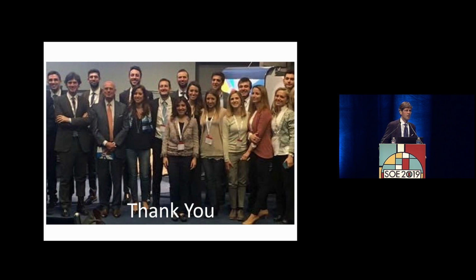What I can only propose and suggest is to always use the same machine when we try to follow the patient, at least. But also in this way, we are not sure. Thank you, because for example, in regular OCT, you have 10% difference between morning and evening. It was also demonstrated for OCT-A that from different moments of the day, but also after exercise or something else, it may change dramatically. Thank you very much.